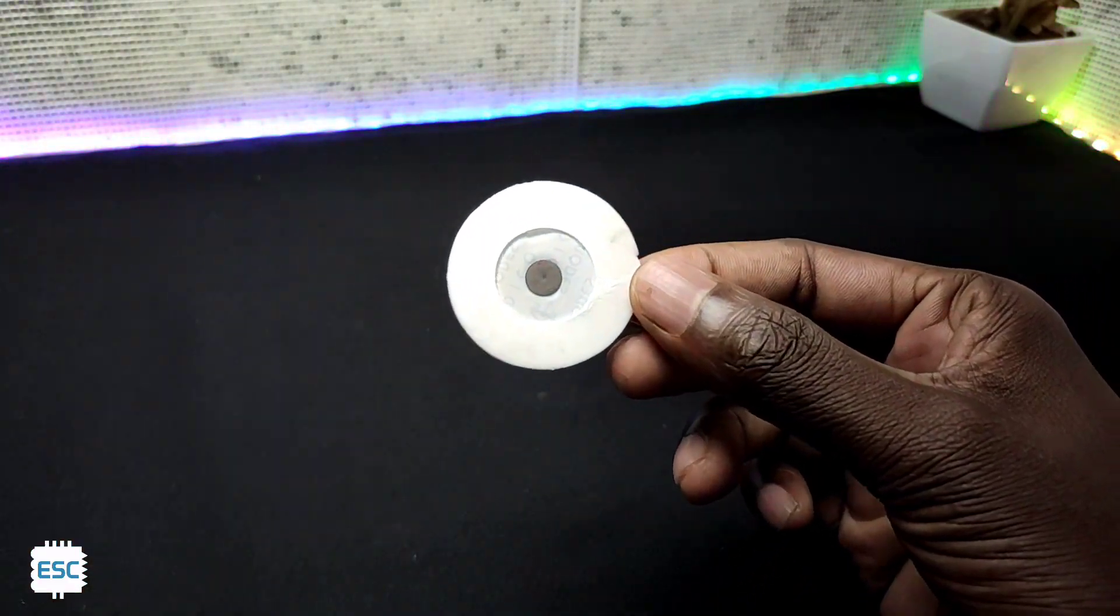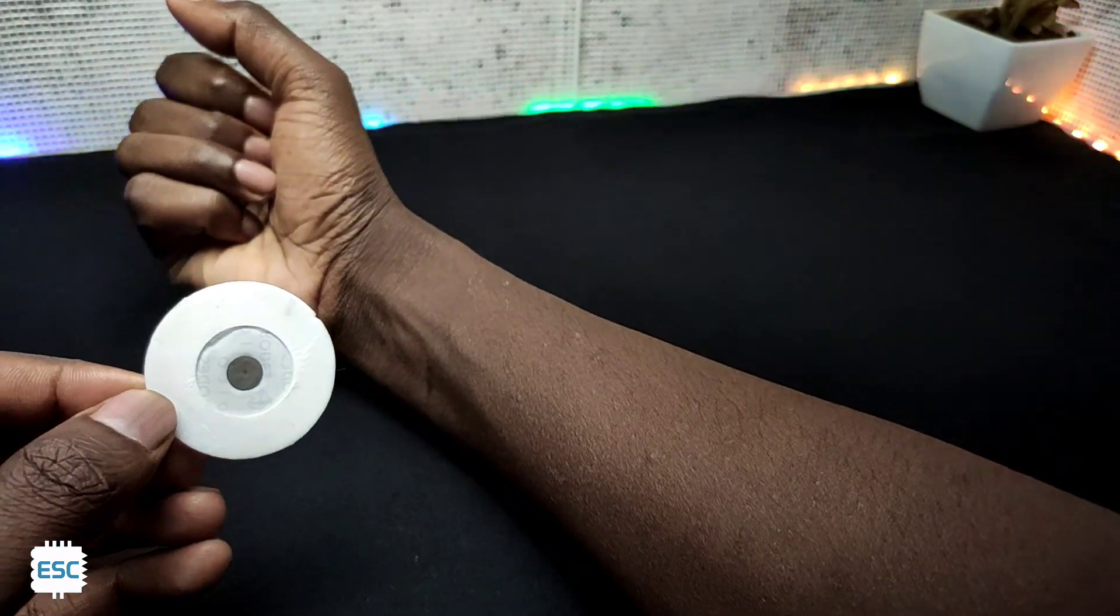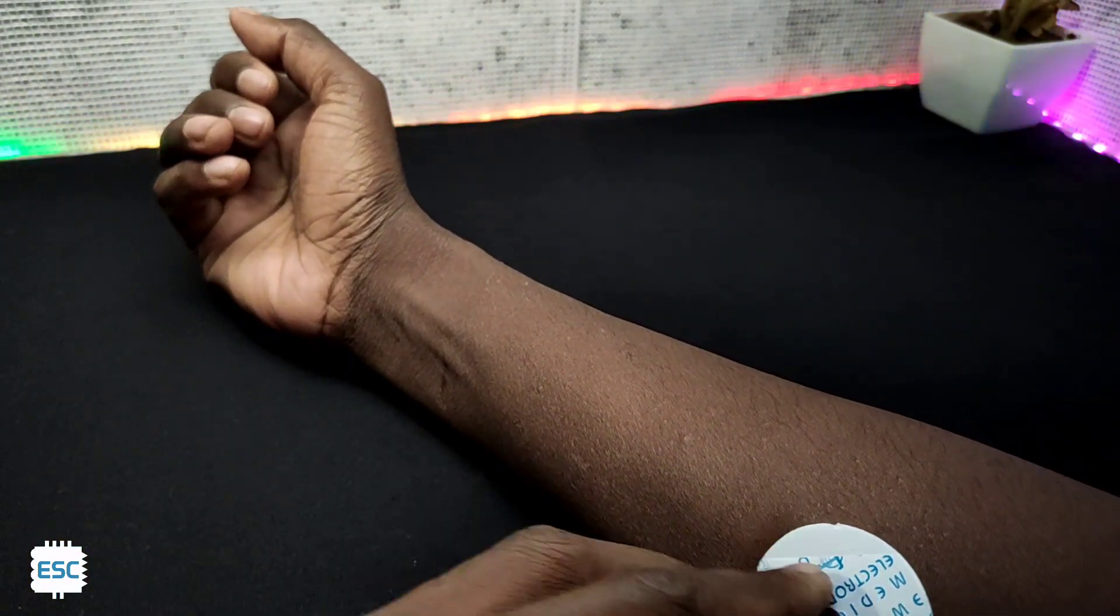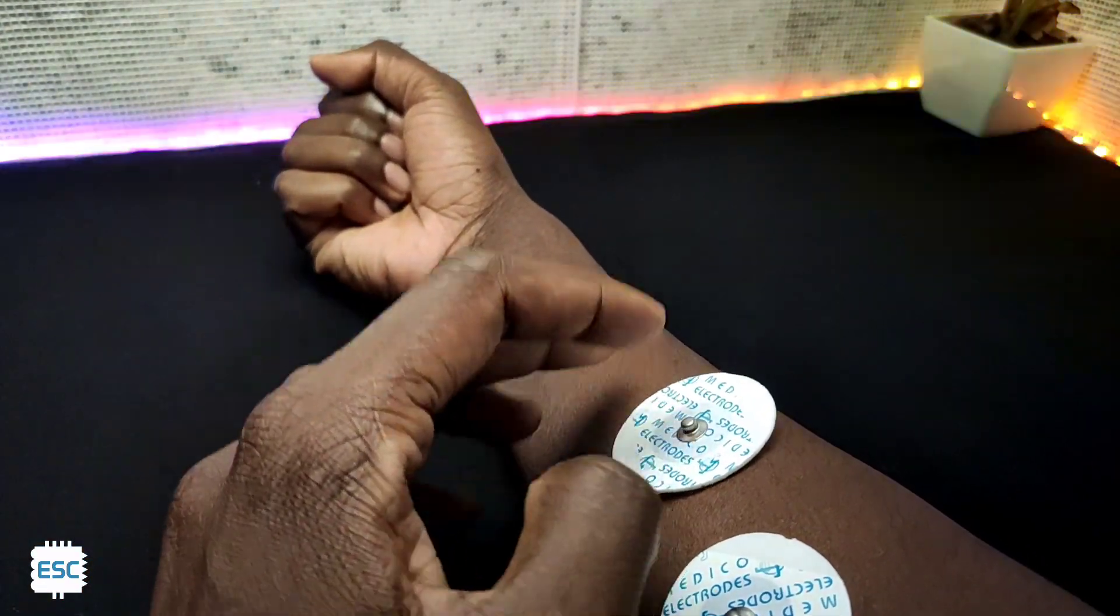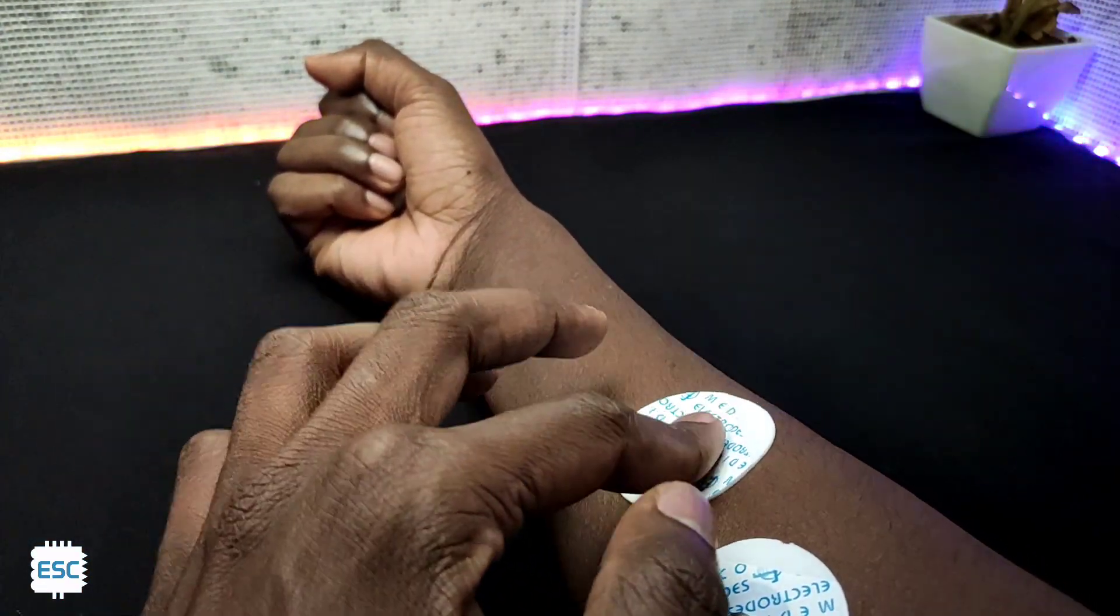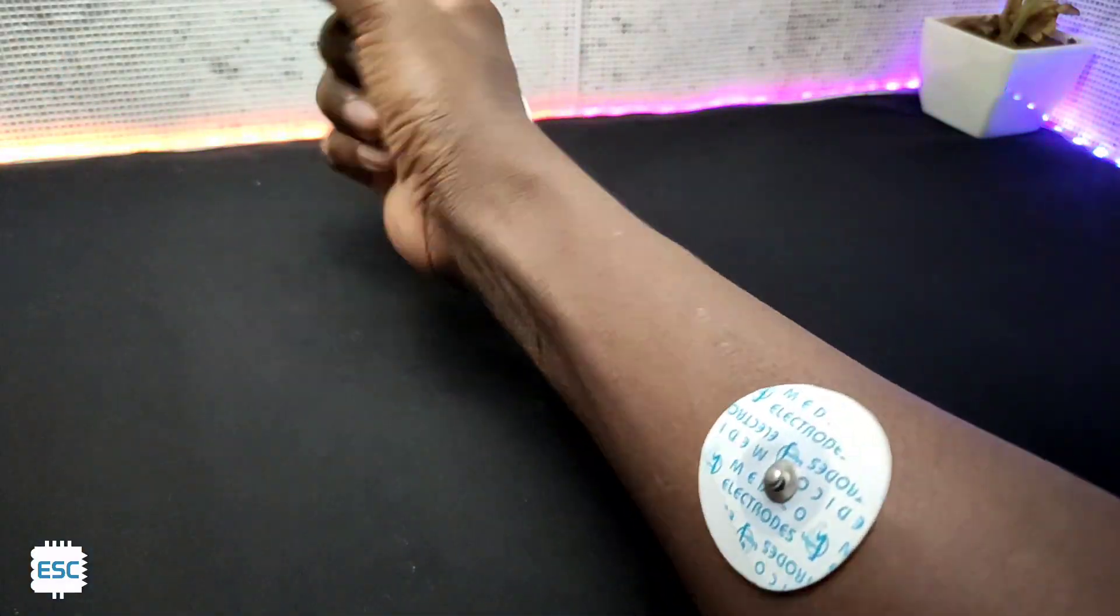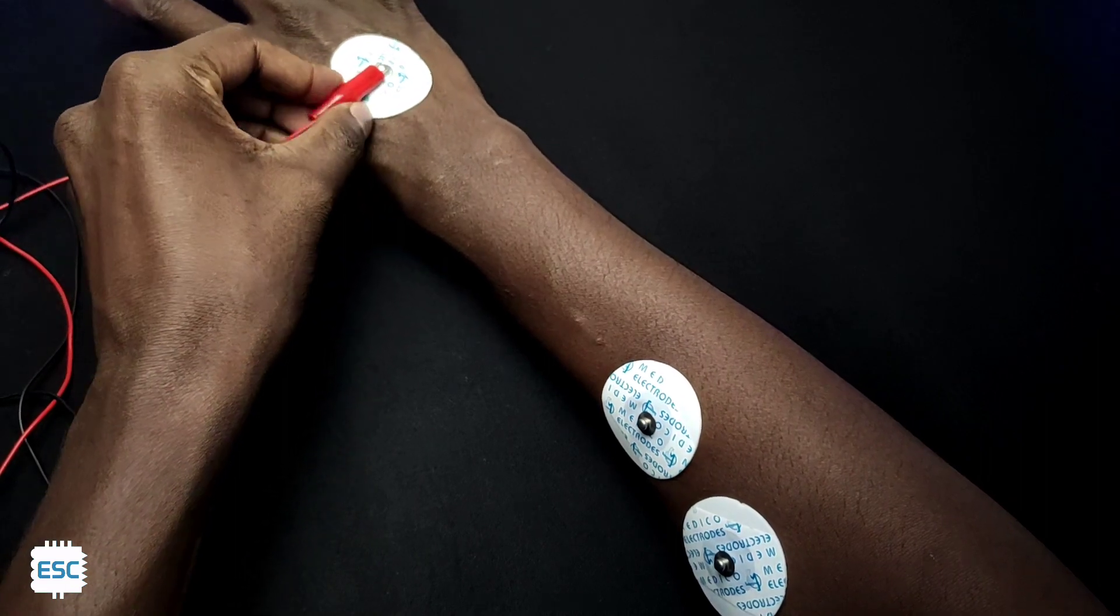Now let's open the covering of the gel electrode and place it on my arm. I placed the electrode at that position because the ulnar nerve goes through there. Next, I placed one on the dorsal side of the palm. Now let's connect the probes to the electrodes.